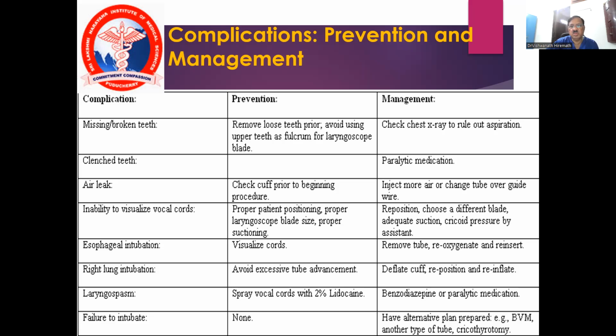Management of the complications following endotracheal intubation: better to have a chest X-ray to rule out aspiration. The patient should be given adequate muscle relaxants.